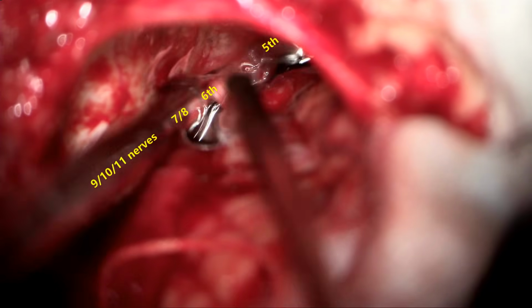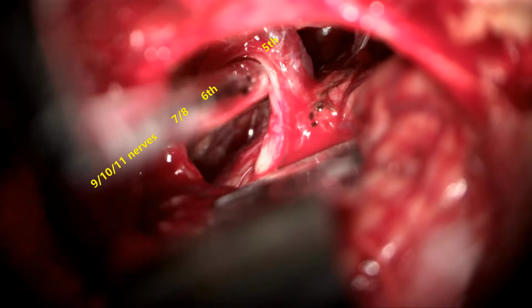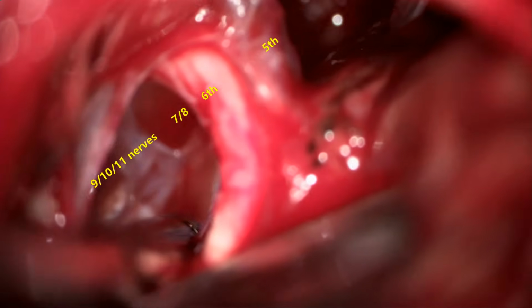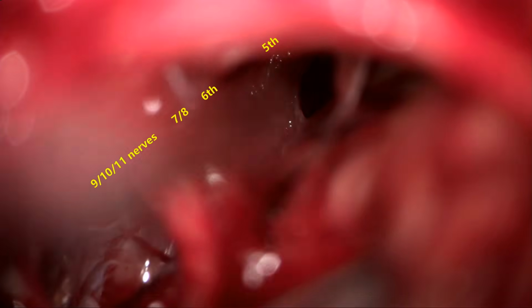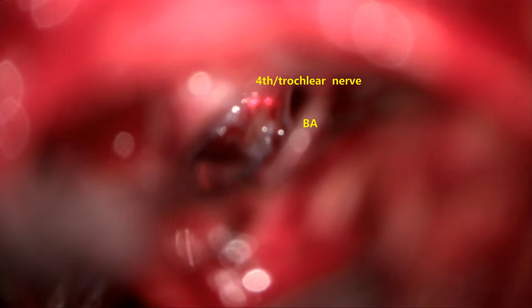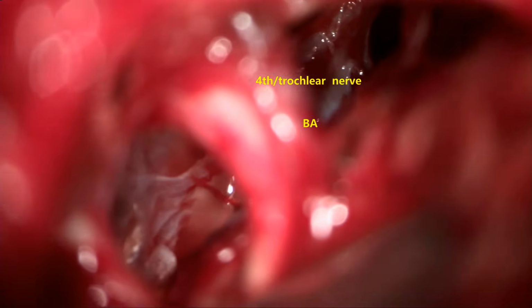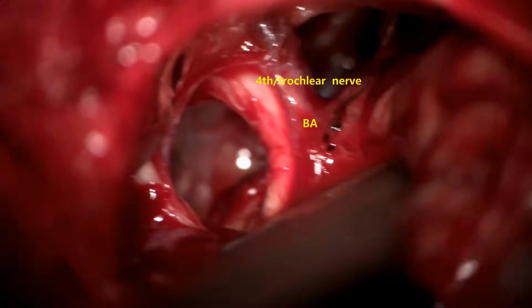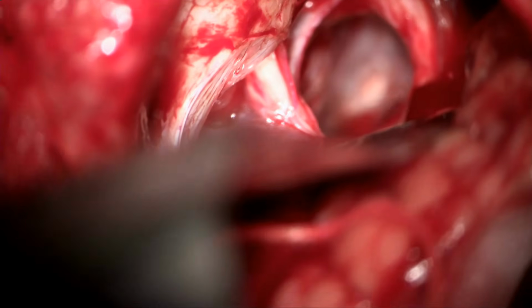Now you can see the cranial nerves from top, 5th cranial nerve, 6th cranial nerve, 7th, 8th, and 9th, 10th, 11th cranial nerves are seen very well in the lateral cerebello-brainstem space. That's the basilar artery anteriorly. You can see the trochlear nerve there superiorly, and the basilar artery and the branches of the basilar artery and perforators going to the brainstem, that's midbrain and pons, are seen very well.